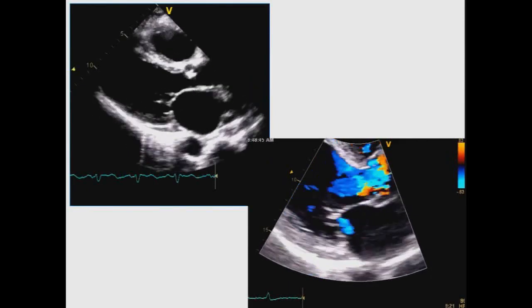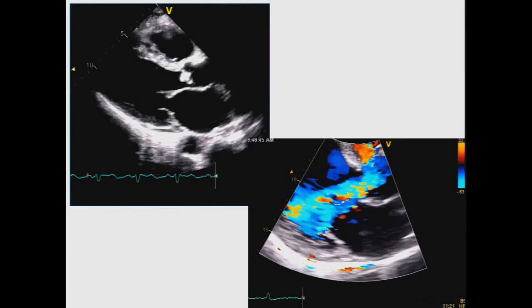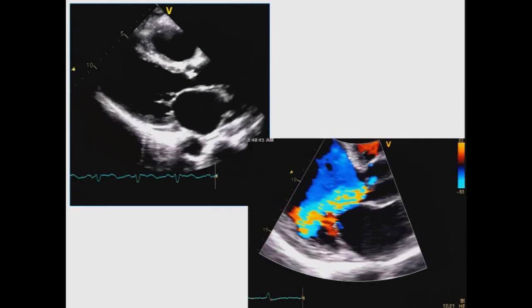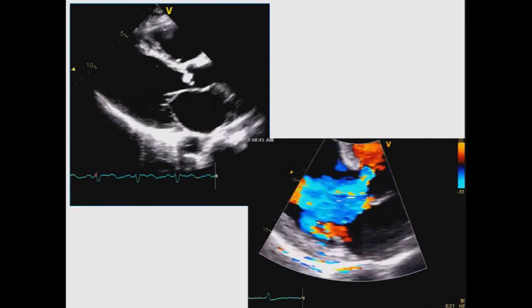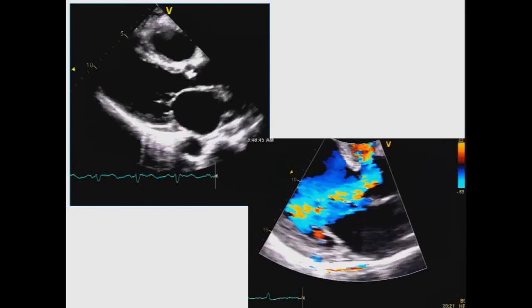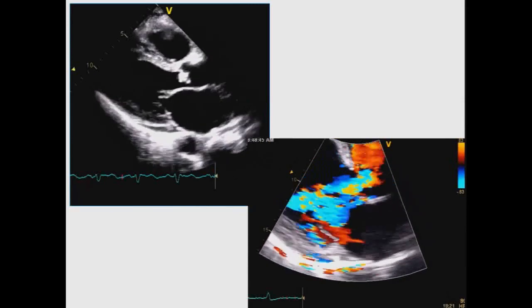What degree of mitral regurgitation allows for accurate diastology? I can talk about this on Tuesday when I give the diastolic talk, but I think the better way of asking the question is, what is the etiology of the mitral regurgitation?